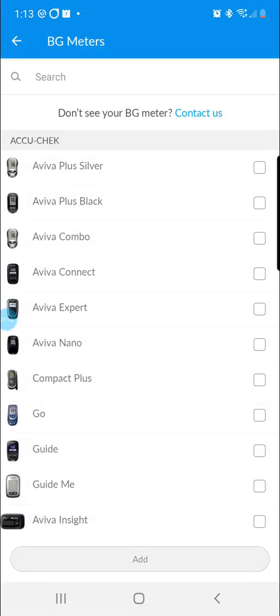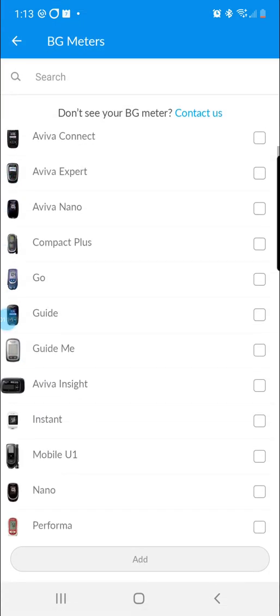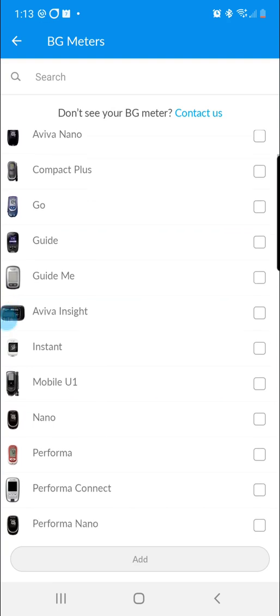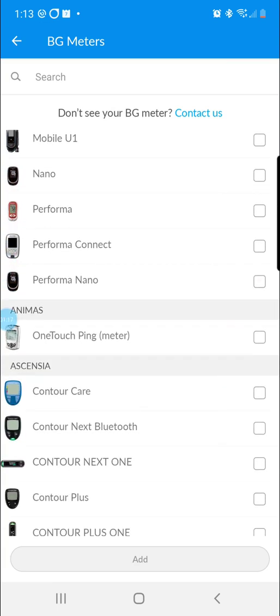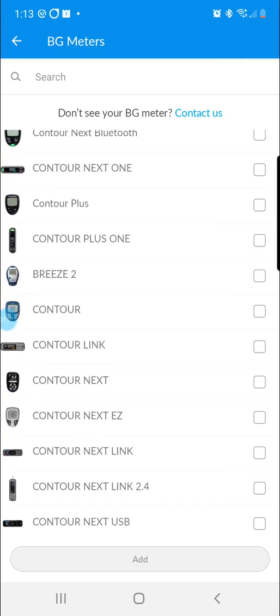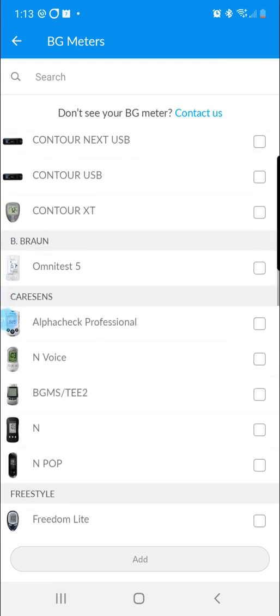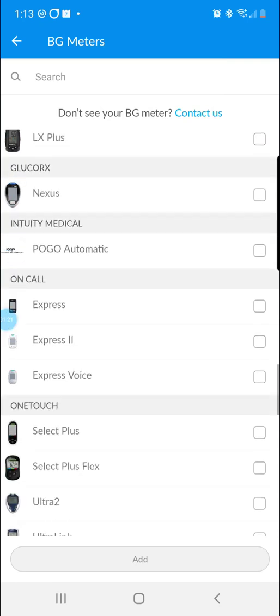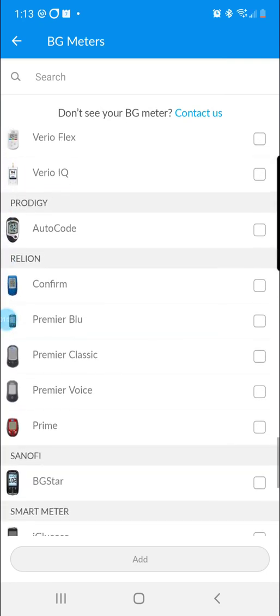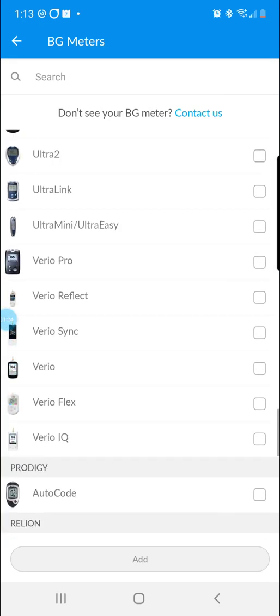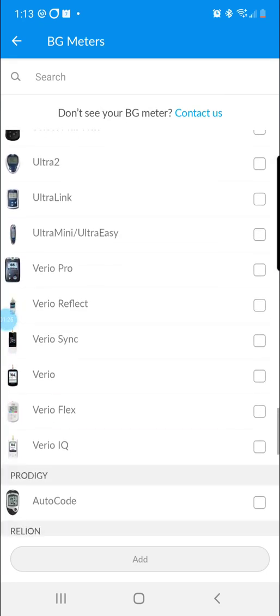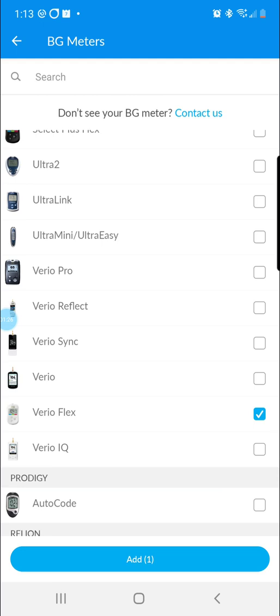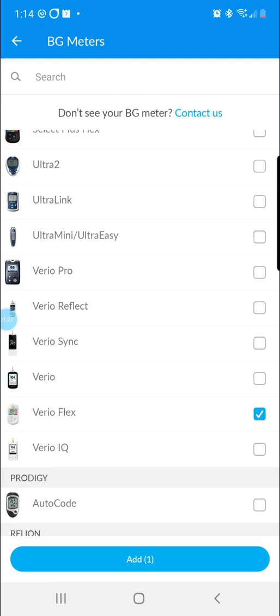From here, you're going to scroll down in the list of compatible devices to where it lists the OneTouch meters and select VarioFlex and then click add.